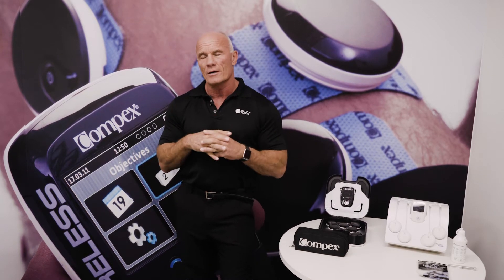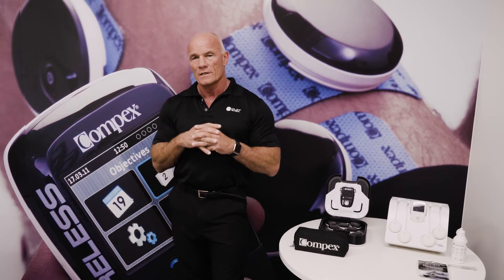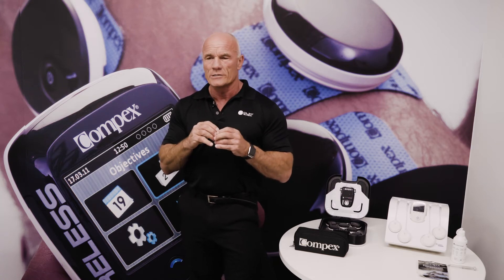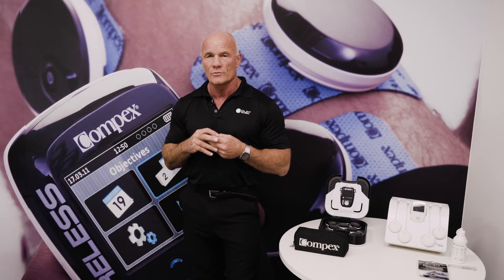By changing the frequency, we can actually influence different fiber types. We can target Type 1 endurance fibers, Type 2a, and Type 2b simply by changing the frequency. So whether we're dealing with an endurance athlete or a strength and power athlete, we can address that. For stability muscles, which have a high proportion of Type 1 fibers, we can find programs to help with that.